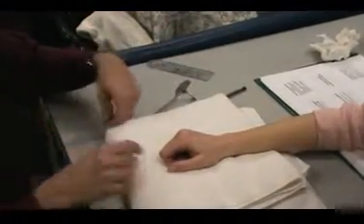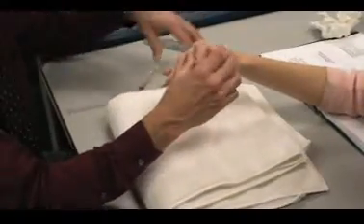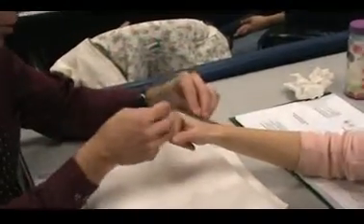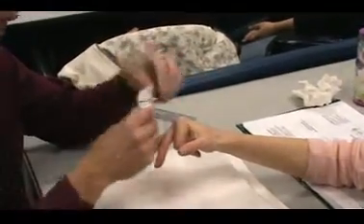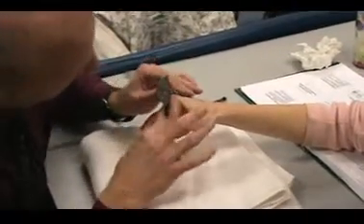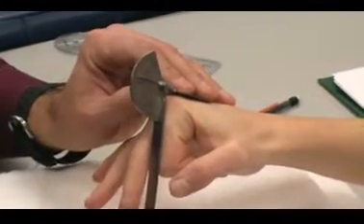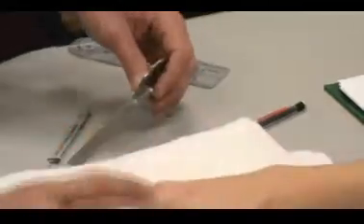You could measure the MCP at the finger — at the first index finger — in the same way. You could use the long goniometer this way, but I kind of like to keep that out of the way. Get right over the joint, and then we can measure MCP flexion.